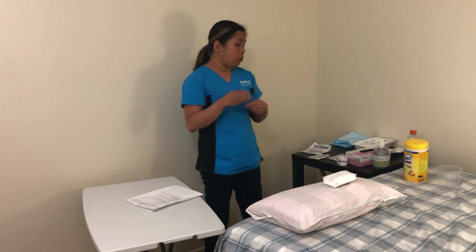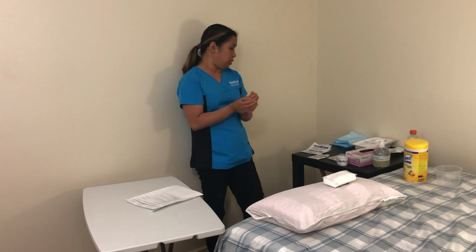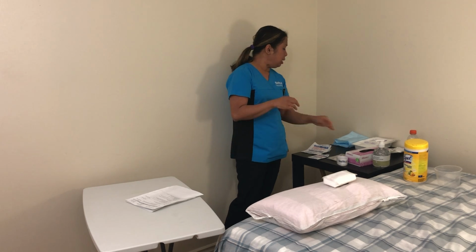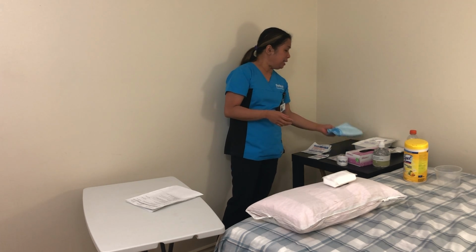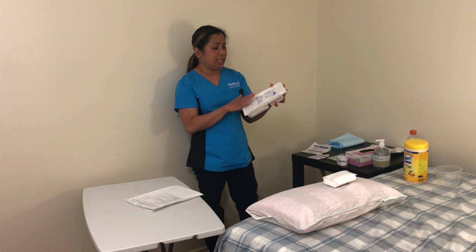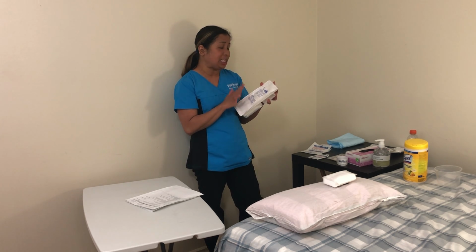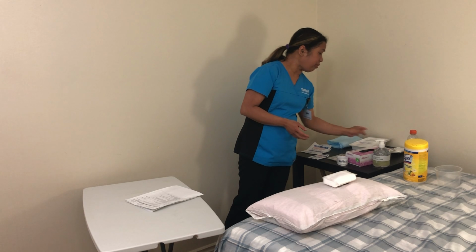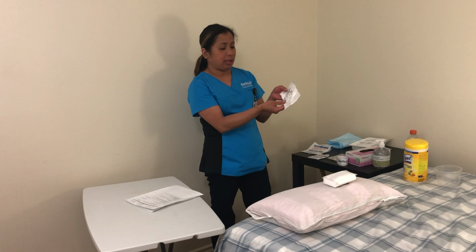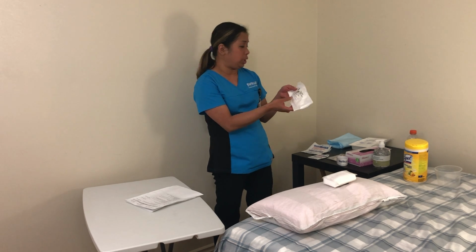Now I'm going to wash my hands to prepare all my materials needed, to maintain hand hygiene. This is my blue underpad. This is my sterile dressing tray, assuming it is not yet open, and there is no expiration date. Now, this is the sterile staple remover, assuming it's not yet open. The expiration is July 10, 2023.